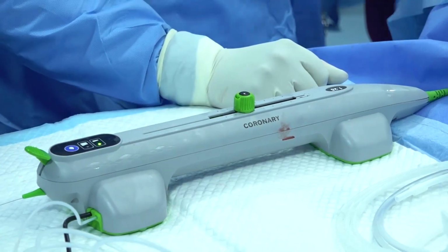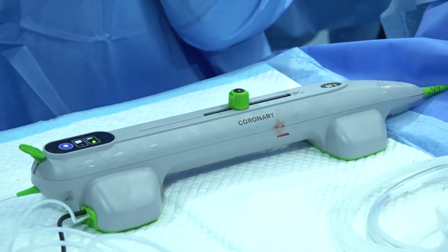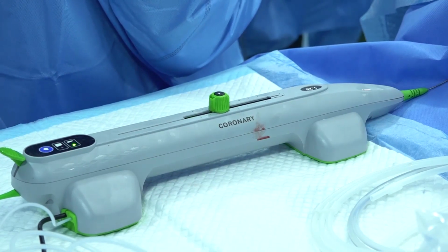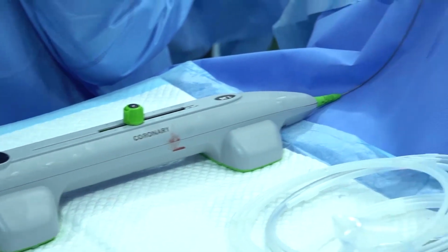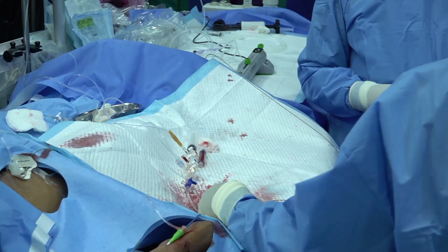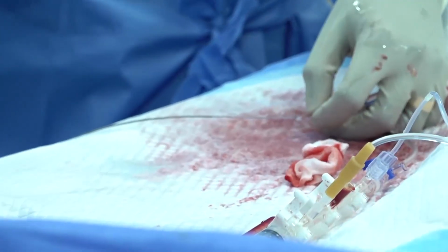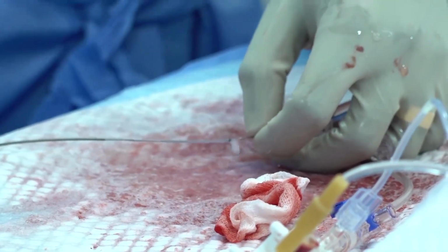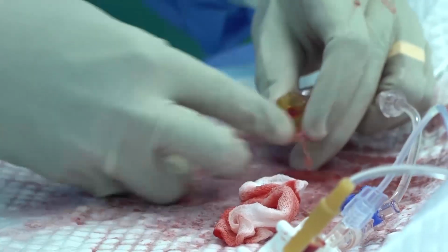This is what you would always want, to have the knob maximally distal, so that you have almost 7 to 8 centimeters of burring space. Keep it towards the end, but unlike rota, you don't really have to have it in the middle portion, and you do not have to release tension much, because when you go with the glide assist mode, you wouldn't develop any tension inside this. And it easily navigates inside compared to rota. It's much easier, another advantage.